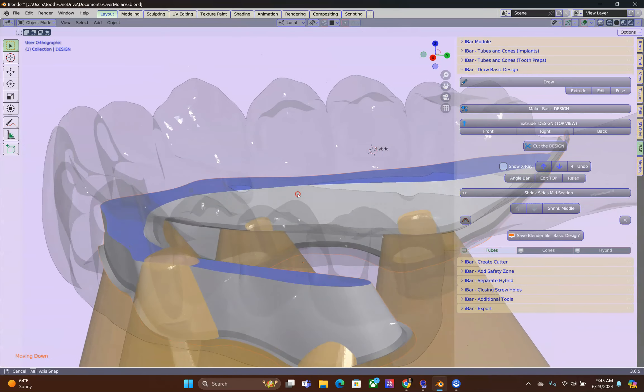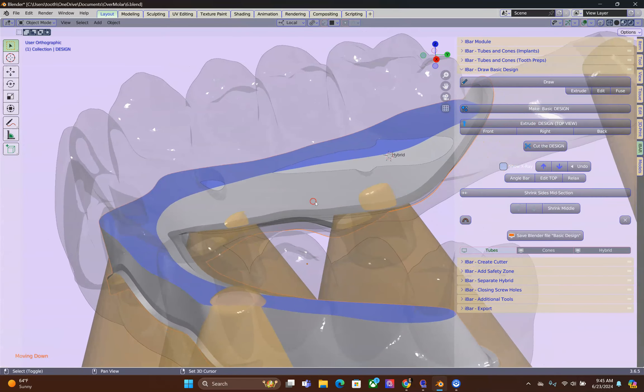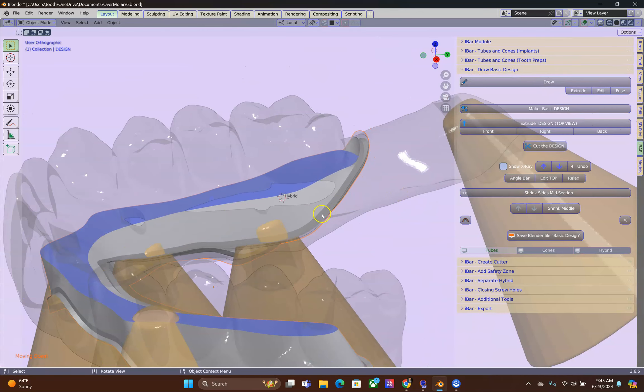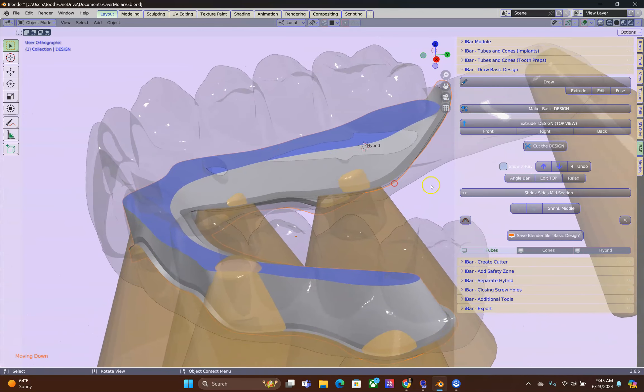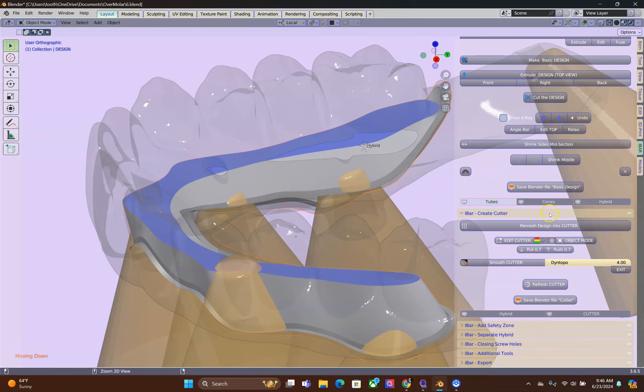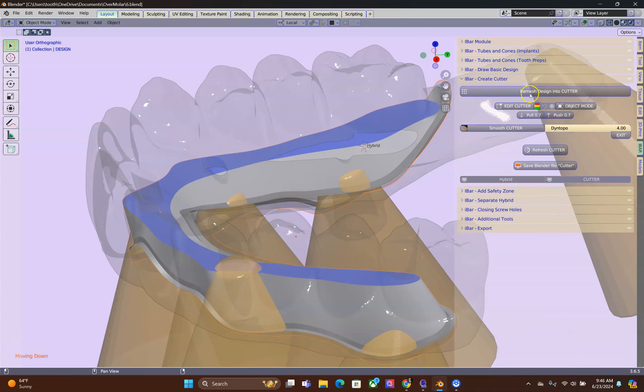Following that, we're going to convert this into a cutter. Open the next menu. And then remesh design into your cutter.